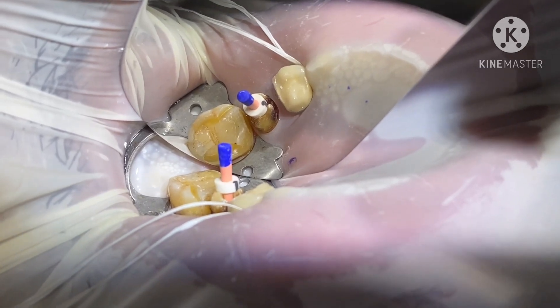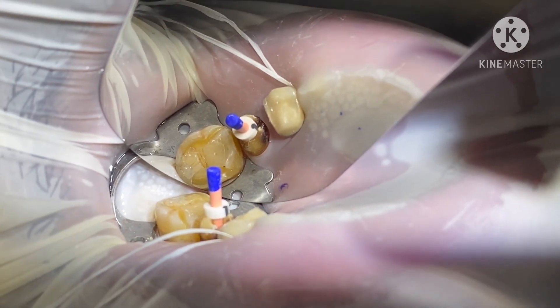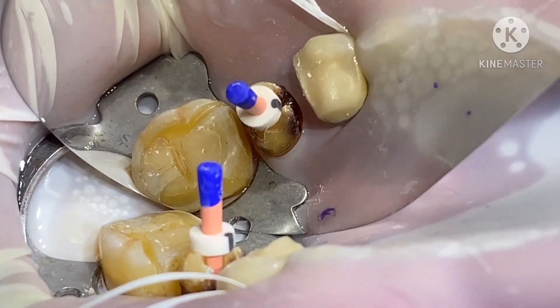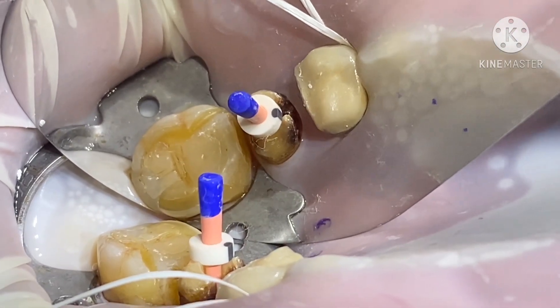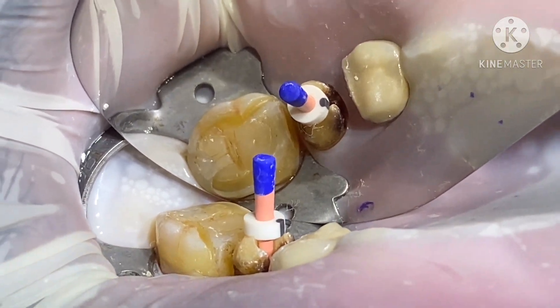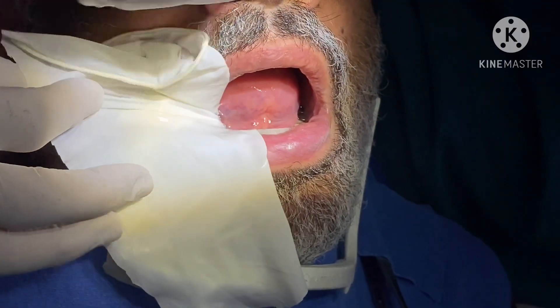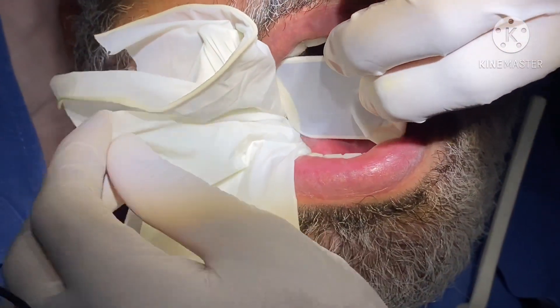This is another appointment of the same patient using the rubber dam sheet cut out of an examination glove. You can appreciate that the whole gingival wall is clear and the rubber dam is covering the other area. The patient confirmed not a drop was going inside his mouth. To take an x-ray, we remove the rubber dam from one side and fold it like this, then place the film and take the x-ray.